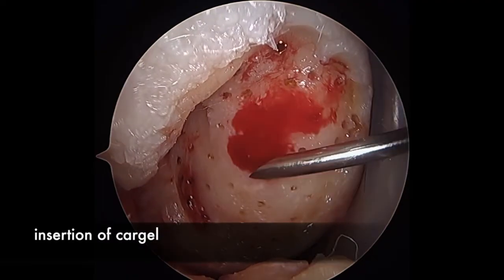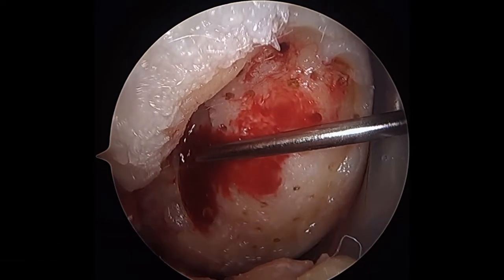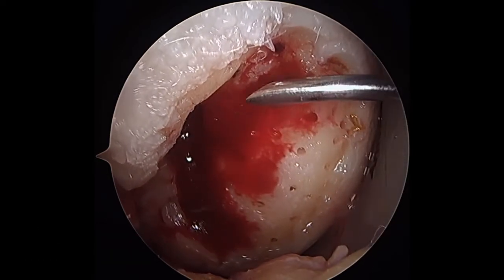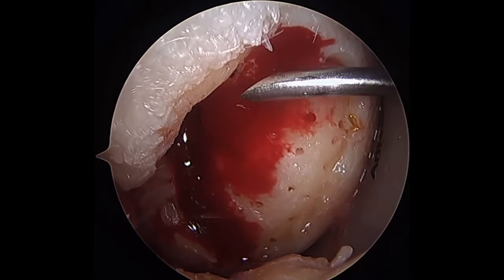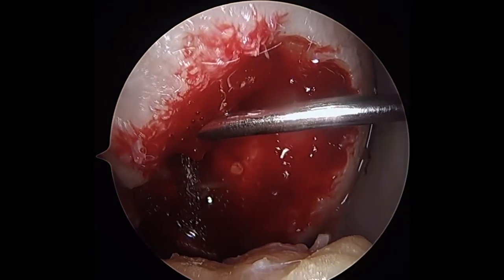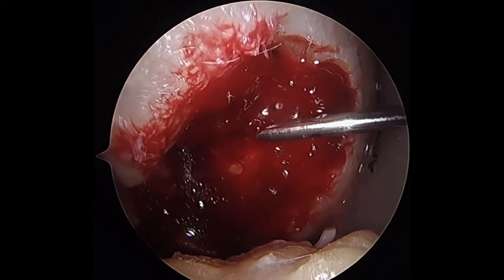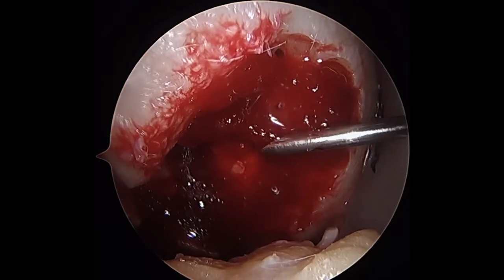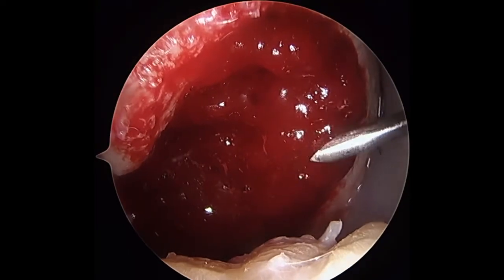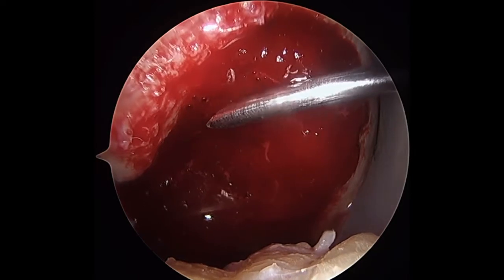A 16 gauge needle containing the CARGEL mixture is inserted into the medial passport cannula. It is applied in a stepwise approach, drop by drop, to recreate the three-dimensional structure of the defect. All 5 milliliters of CARGEL was used to recreate the defect in its entirety.